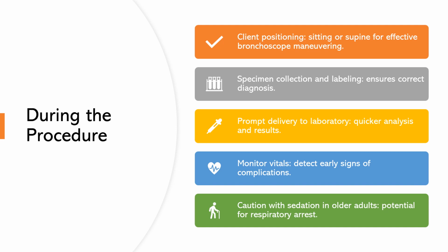Let's talk about monitoring. Keep a close eye on your client's vital signs, respiratory patterns, and oxygenation status throughout the procedure. Your meticulous observation can help detect any early signs of complications, and that lets you immediately intervene.